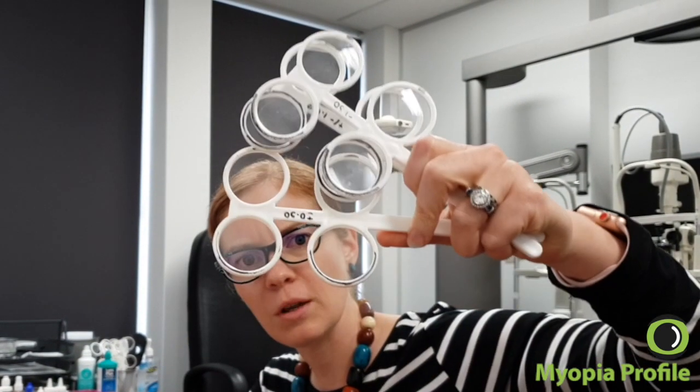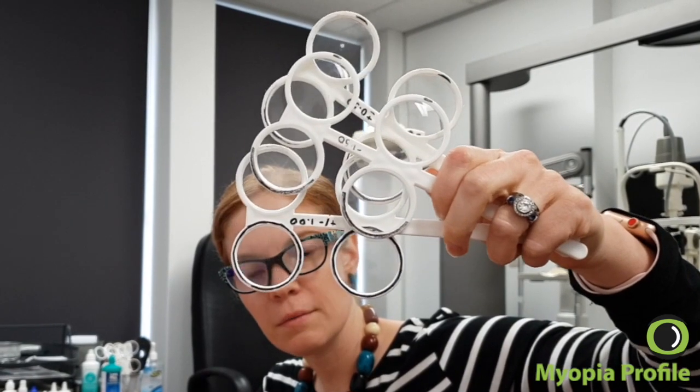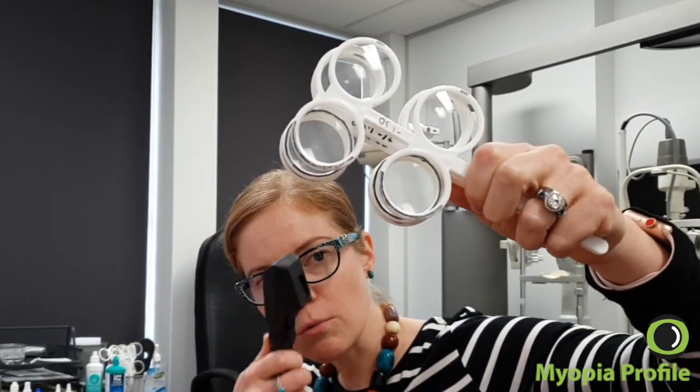So what I'm doing here is flicking between plus 0.50 and plus 1.00. You can very quickly with your RET just scan across and have a look at the reflex. We want to pop it over both eyes at the same time so they have the same accommodative demand. When you flick between the two — if you're getting 'with' with the plus 0.50, and 'against' with the plus 1.00 — the answer is plus 0.75. Easy.